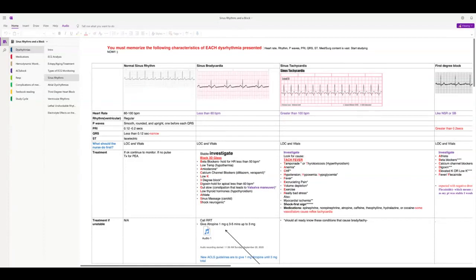Okay, the ST segment needs to be isoelectric. I wouldn't even sweat this, okay? When we get to coronary artery disease, I'll show you some elevated ST segments and some lower ST segments, but the rhythms I am teaching you are all very basic rhythms, okay? Simple, simple, simple. So we're not going to worry about that just yet, okay?